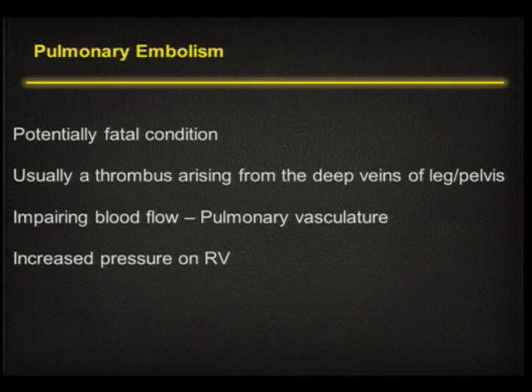Coming to the last topic, echo and emergencies. This is about pulmonary thromboembolism. We all know that it is a potentially fatal condition, and it is one of the few conditions where we tend to overdiagnose or underdiagnose, and when we underdiagnose, either in the form of not diagnosing or a delayed diagnosis, the consequences can be quite lethal. So it's important that we have a timely diagnosis.